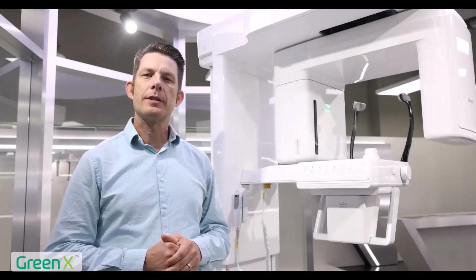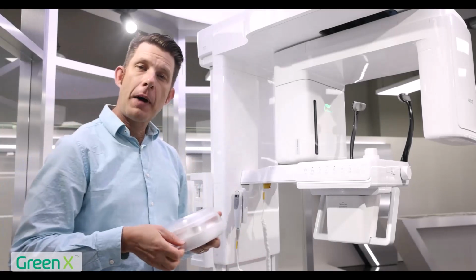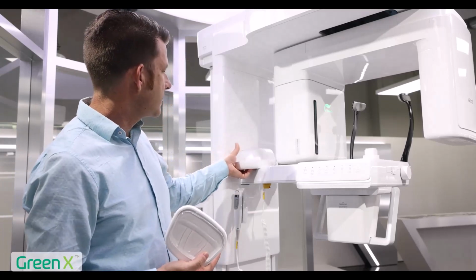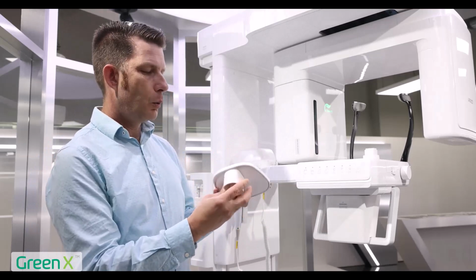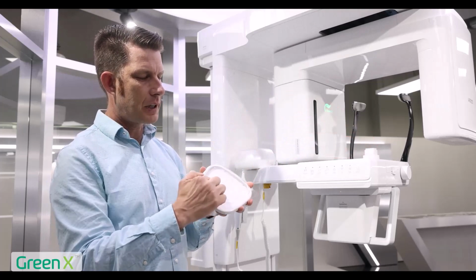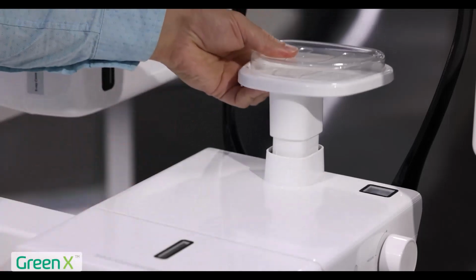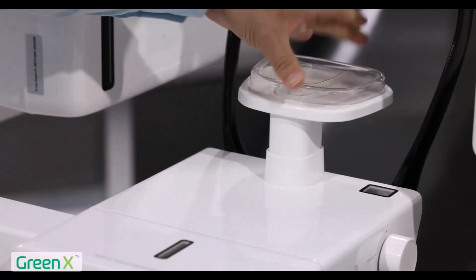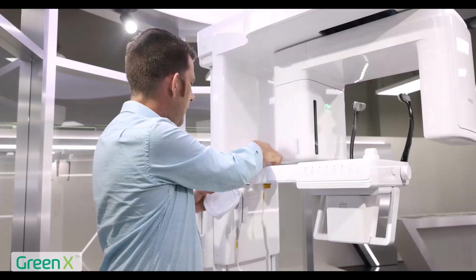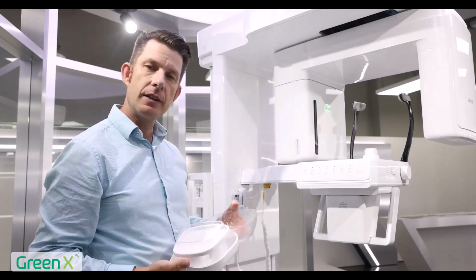One other appliance I want to look at is the model scanning platform. Let me grab that. Your model scanning platform comes in this case. Let's go ahead and set this here. So your model scanning platform will fit where the chin rest was. And if you notice on top of the model scanning platform, there's this clear plastic. This is where your cast model will sit. Simply place the model scanning platform in the device right there. So I'm going to go ahead and remove that. We'll put it back in its case here. And we're going to go ahead and place the chin rest back into the device.